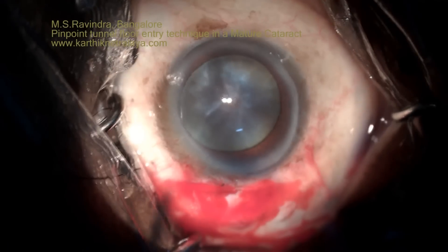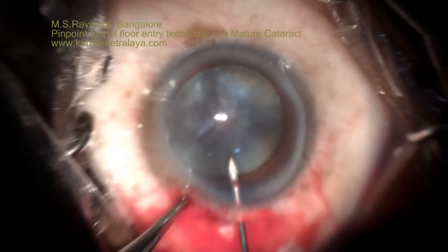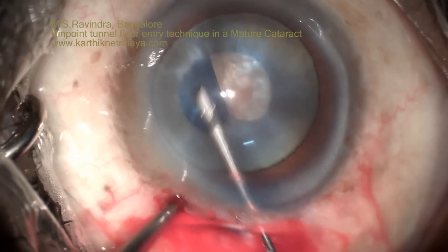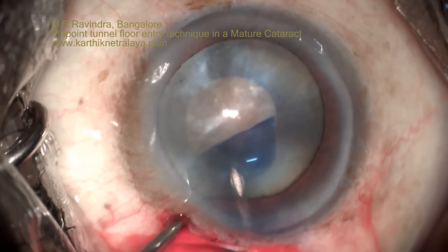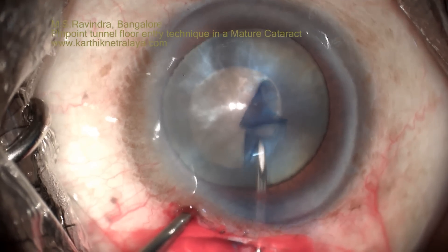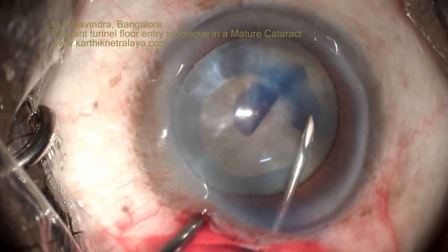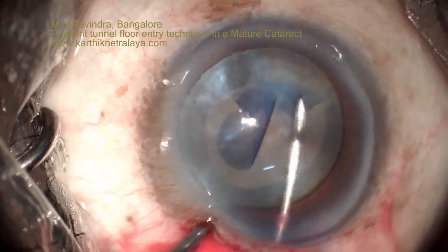The surgery can be done very elegantly. The sclerocorneal tunnel in a mature cataract can easily be handled by the tunnel floor entry technique. There is no shallowing of the anterior chamber, and the tendency to run off to the periphery is minimal because the viscoelastic is trapped in the anterior chamber. Rhexis can be completed even in Morgagnian cataracts without the risk of running off to the periphery.